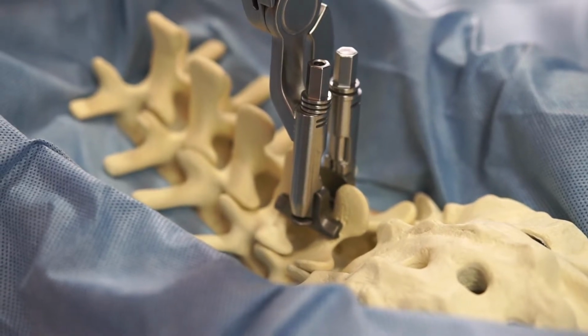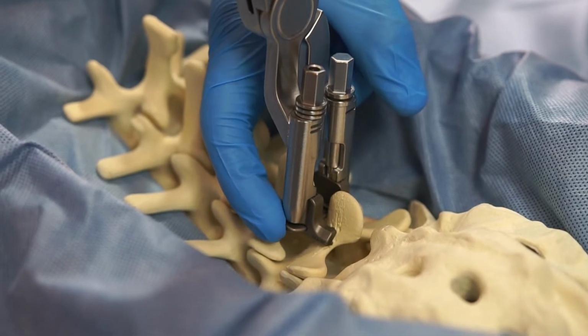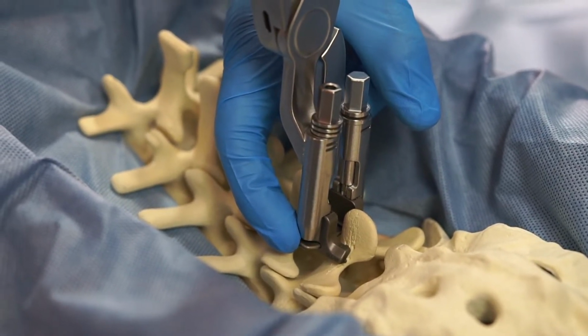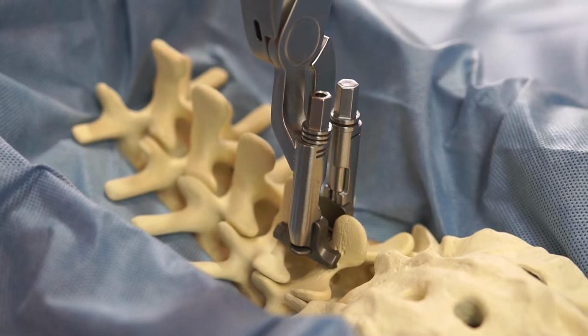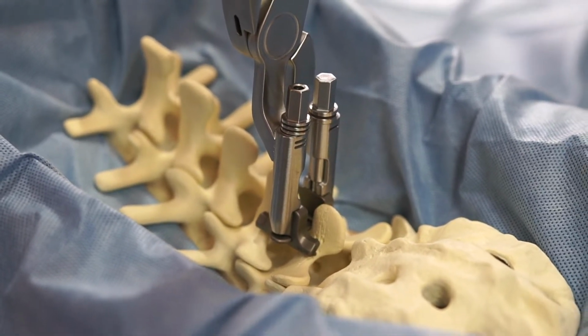It is important to always visually confirm that the tip of the tray is visible past the locking plate to ensure that the set screw will properly engage the tray. Confirmation of the implant alignment can now be performed using X-ray or any other image guidance tool as necessary.